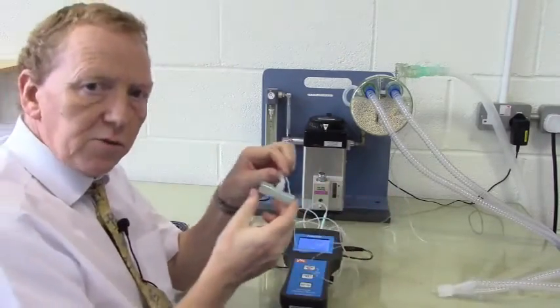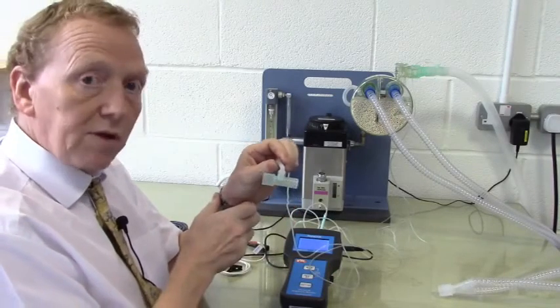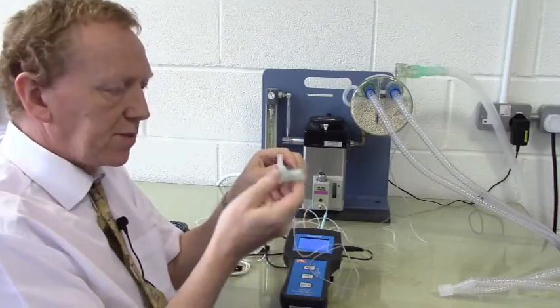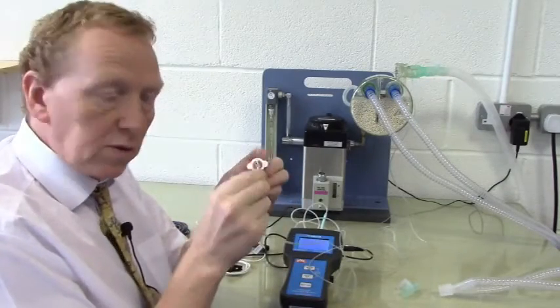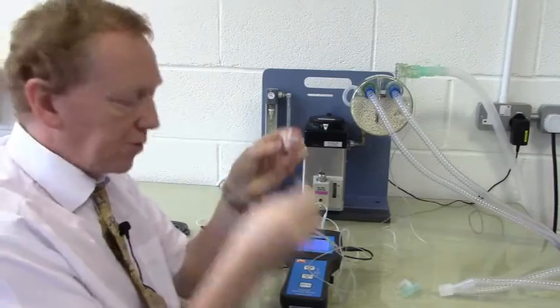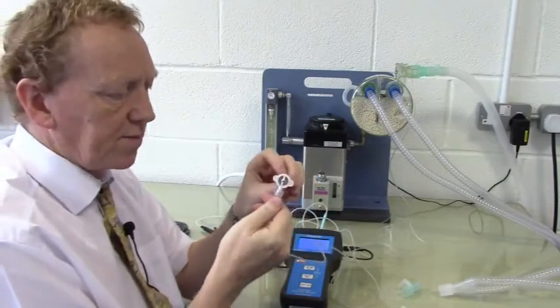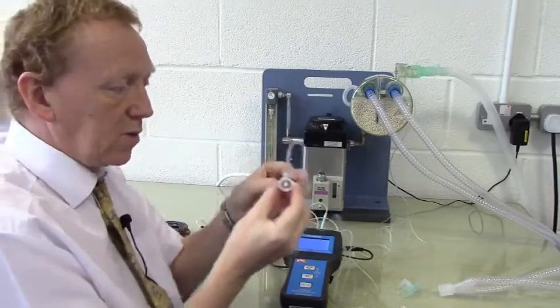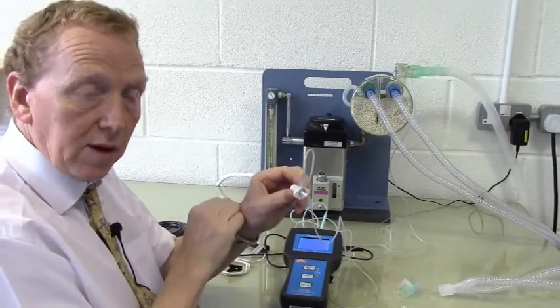This size is suitable for animals down to about 5 kilograms. For animals less than 5 kilograms, it's advised to take this part off and use an ET connector with a side port. In these devices, the small luer connector is removed and the sampling line connected like that. When placed in the circuit connected to the animal, again we should place it like this so that the sampling line is uphill from the airway.